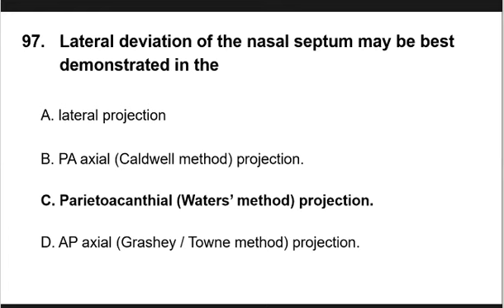Pero bihira tayo dito sa Pilipinas na nag-X-ray sa nasal bone fracture, no, nang mayroong Waters dahil lateral lang. Yun lang ang routine natin. Pero the normal routine for the demonstration when there is a lateral or medial deviation of the nasal septum, ang routine natin dyan, that is Waters and lateral. Pero specifically, for the lateral or medial deviation of the nasal septum, Waters method yan.